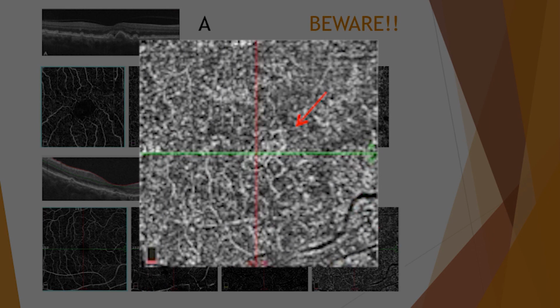So when I show this slide, when I do this lecture, the ODs look at it and they're like, wow, how much have I missed over the years, right? It's like, this is crazy. We see these every single day. And I certainly was not as aware then as I am now about how much we're missing, how much we're not seeing. So that concludes my part of the presentation.